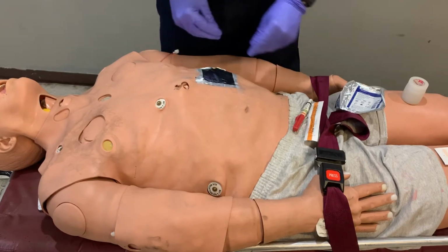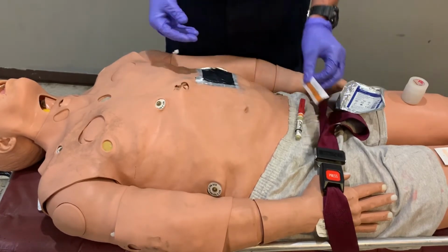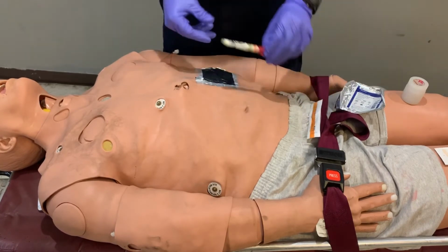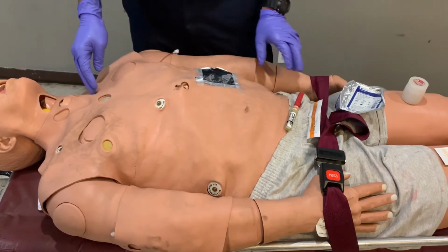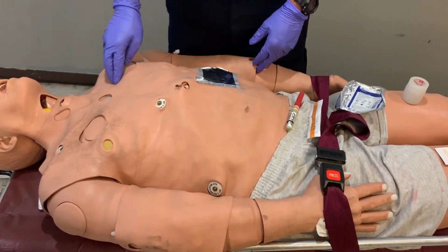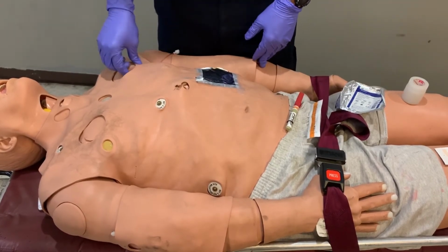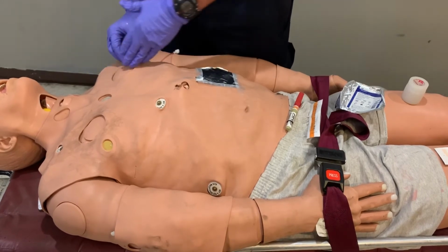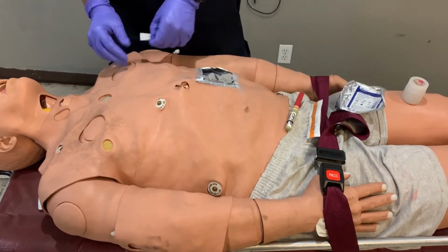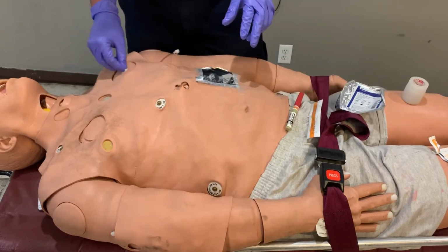With a needle decompression, you'll either use a needle decompression kit or a 14 or 16 gauge or something bigger IV catheter. We'll be doing it with a needle decompression kit. You'll feel for the clavicle, and then down to the first rib and the second rib. Under the second rib and above the third rib, you'll feel a soft spot, and that's the second intercostal space. Midclavicular of that area, you'll take an alcohol prep pad and sanitize the area.